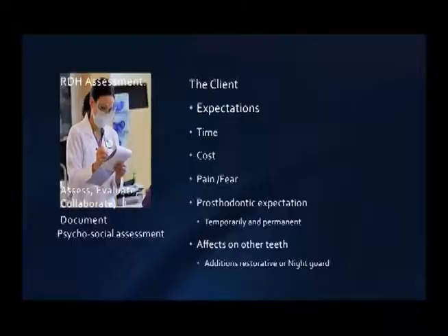Okay, so just going through those things will make them feel more prepared. So as part of the dental hygiene assessment, here are the areas of focus that we need to be able to comment on. If there's some concerns, it's really great to bring those concerns to all the parties involved in the implant team.